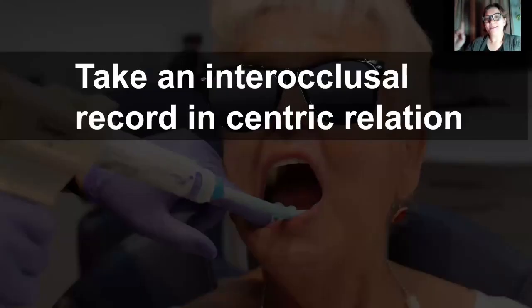After you do your impression, you get your interocclusal record, which is your horizontal, vertical, and orientation record. So you want to do the impression first. If you don't learn anything else about workflows today, this is the one thing I would advise: whenever you're doing any of these steps, for a conventional workflow, a digital workflow, or a reference denture, it doesn't matter, you always do the impression first to stabilize the base before you take your records. Whenever you put the impression material in, it can shift that base even very slightly, but that can be enough to completely throw off your occlusion. So always do your impression first and then get your interocclusal record.